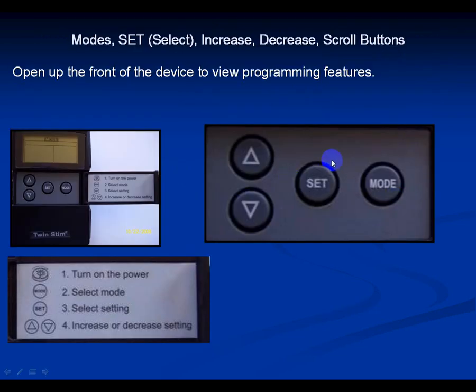Now let's briefly go over the programming center. You have a mode button, a set or selection button, and buttons for moving up or down the parameters within a setting.